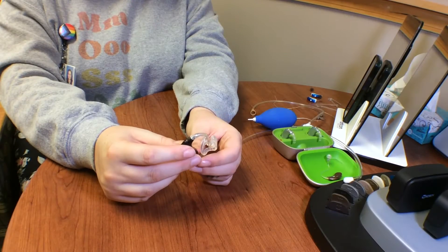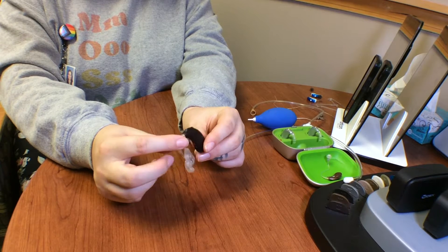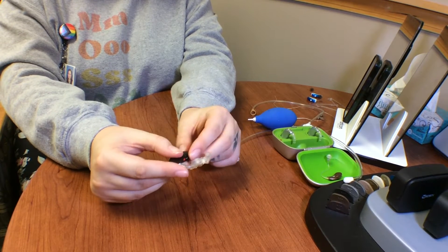Generally, the school team will have somebody designated to do a listening check at the start of the day before the patient has to start participating in school, so that way their equipment is functioning the way it is supposed to. It needs to be done daily and generally first thing in the morning. We are going to perform a listening check on a BTE — that's a behind-the-ear hearing aid — with a battery door.